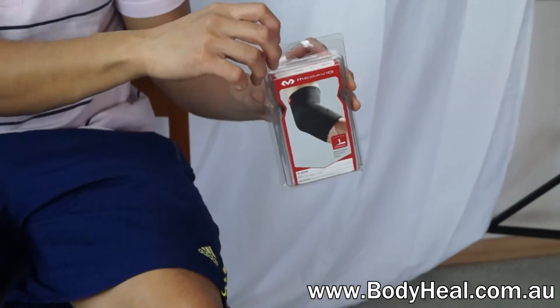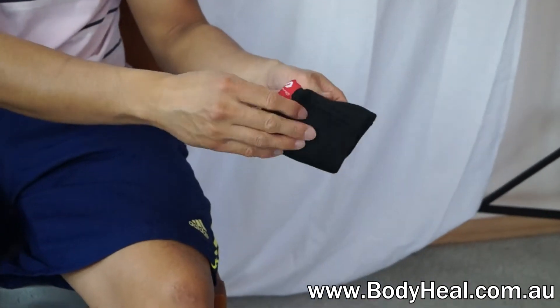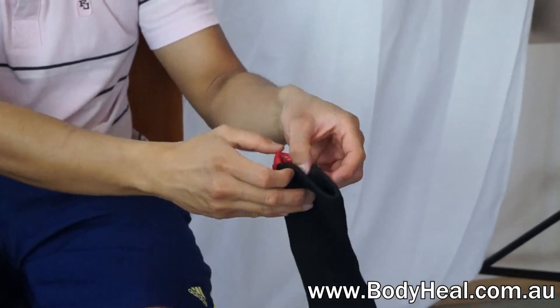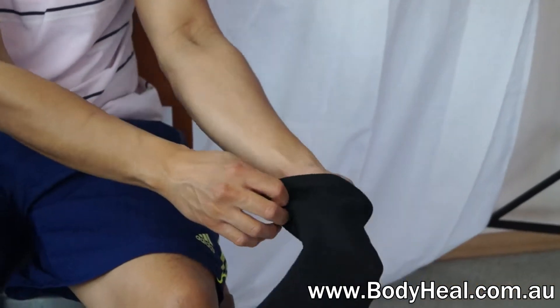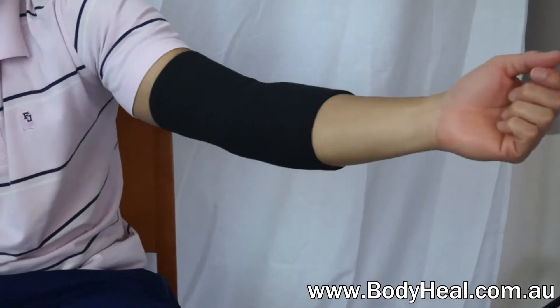The McDavid Elastic Elbow Sleeve is ideal for those with a neoprene allergy. It provides remedial compression without the heat-returning effect of neoprene. It's very easy to put on and it's universal — it fits either the left or right elbow.